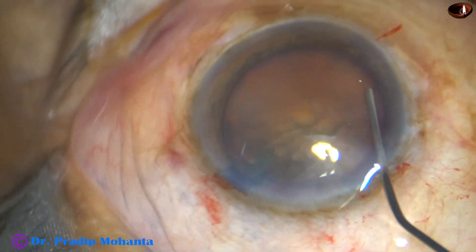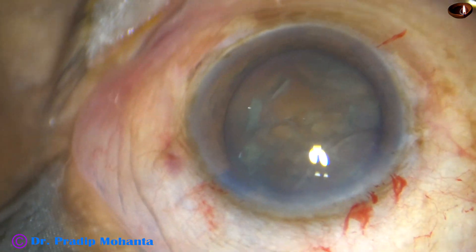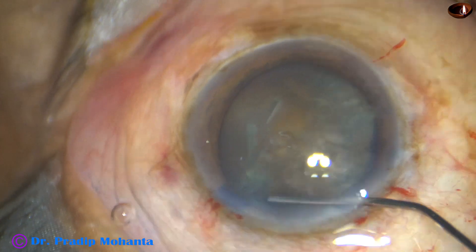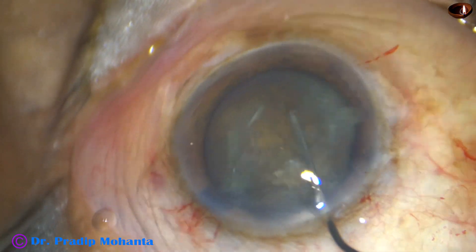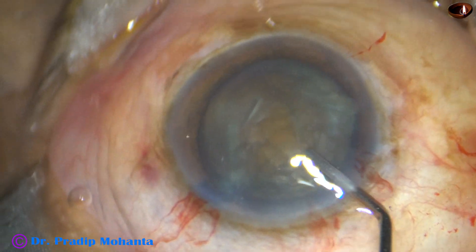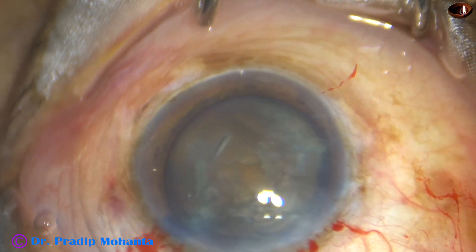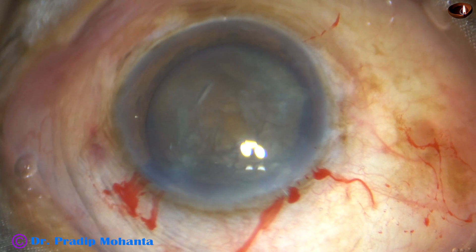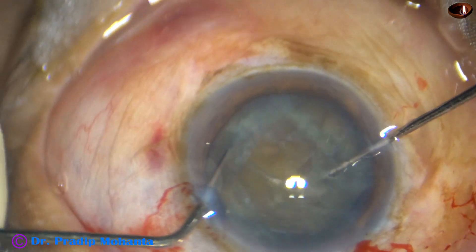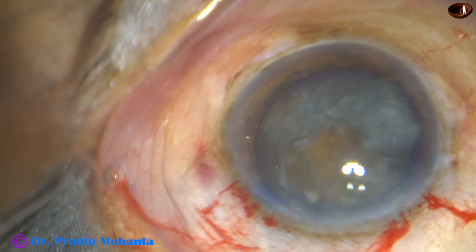Small amounts of BSS are passed at multiple points — this is one point and this is another point. The nucleus is tapped and then another hydro is done at this point with some more ballooning. The nucleus will rotate nicely. But I am going to use two instruments to rotate the nucleus — you can call this bimanual rotation of the nucleus — because with this technique, stress on the zonule is almost nil. If we just push the nucleus with one instrument, there is some zonular stress.